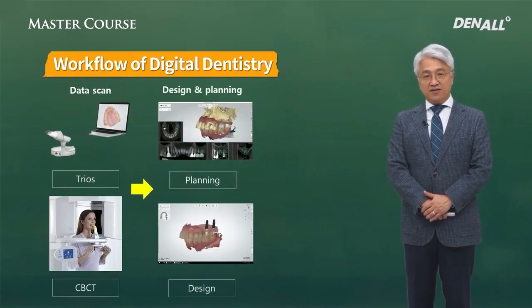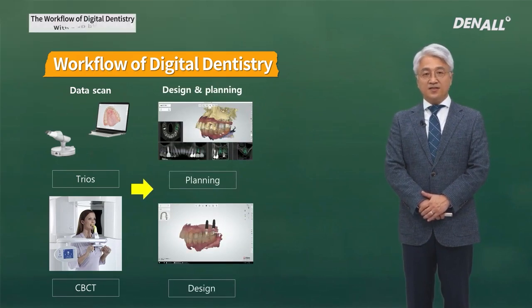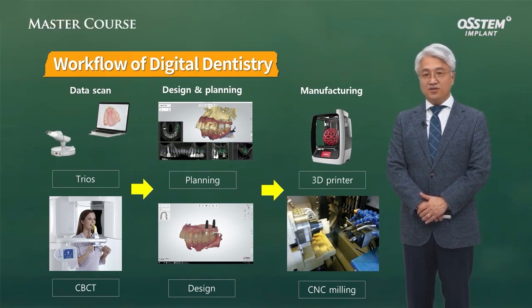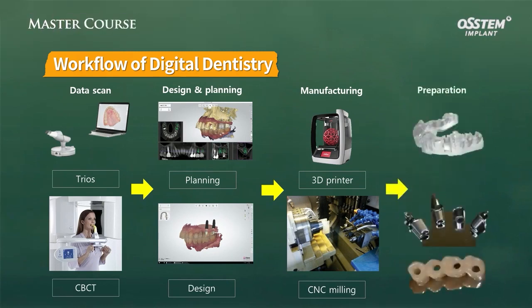Various CAD software is used for designing and planning. Using the design, you use a 3D printer or CNC machine to get prosthesis. You can get these kind of appliances for the patient using this digital dentistry workflow.